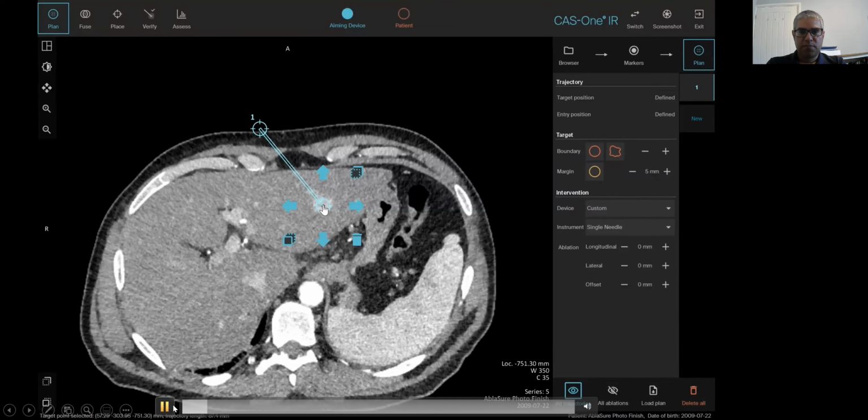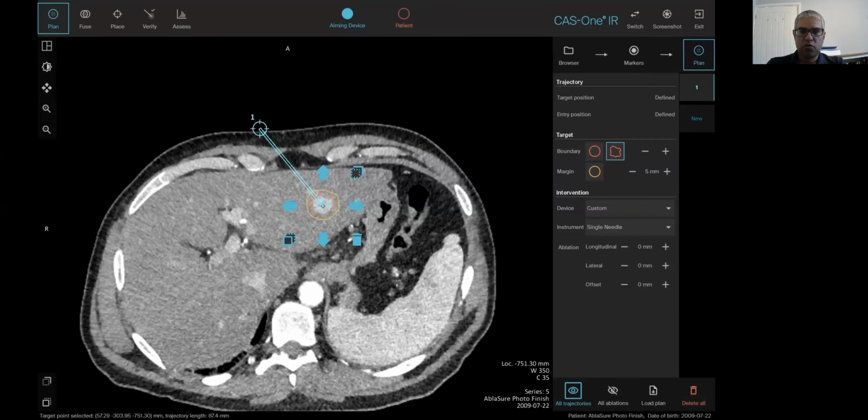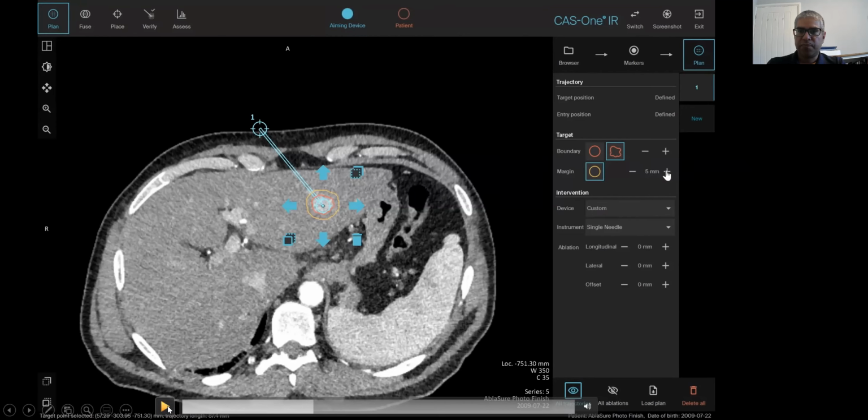So this is how it works. As previously, you start off by selecting and identifying your tumor. What you do next after that is you can either use automatic segmentation for it to identify the tumor, or you can manually correct for it yourself.